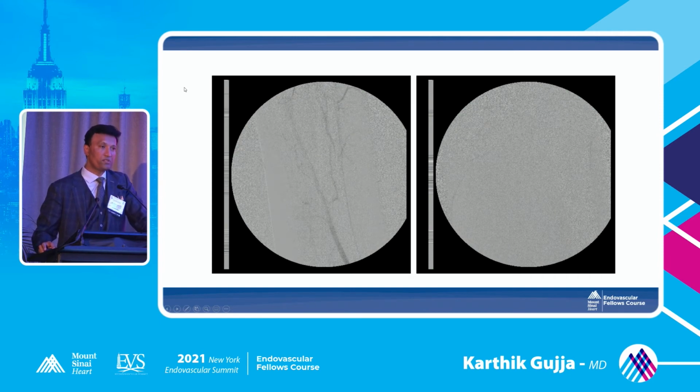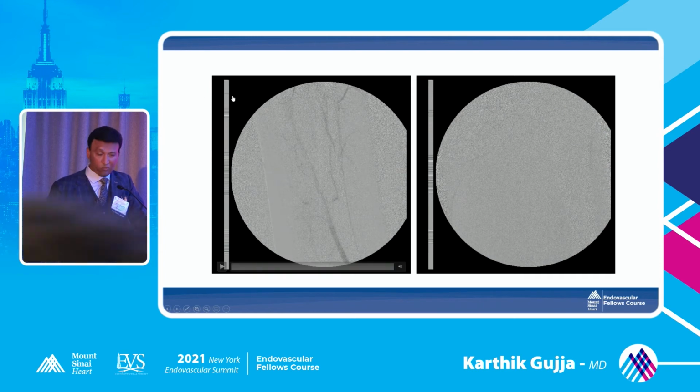So it depends on what you're comfortable with. There are two filters, again, because Dr. Krishna brought it up, so I'll talk about it. Both have their own advantages and disadvantages. One is Spider, which could be a large device. If you're using a 7.0 or a 6.0 Spider, then you get a lot of protection, but the wire is not independent of the filter. So if you're not careful, if you're not a good wire management guy, it depends on you. You have to choose it.